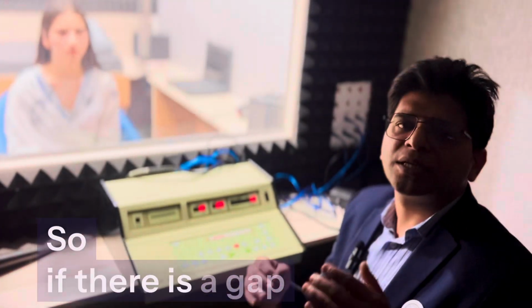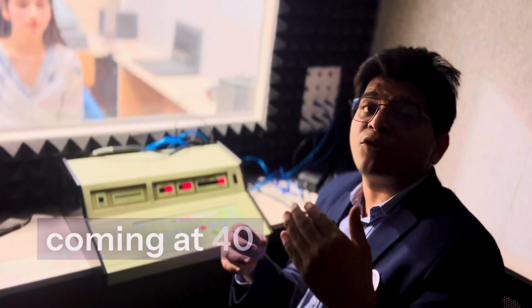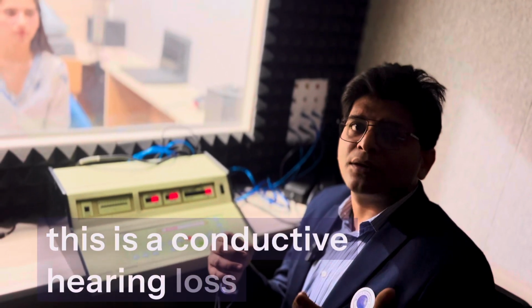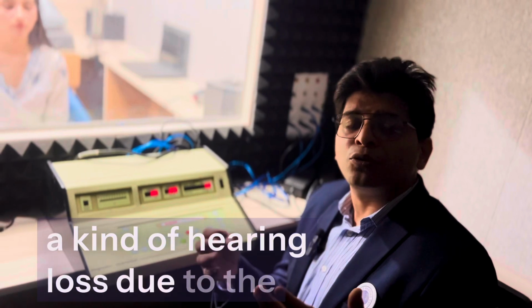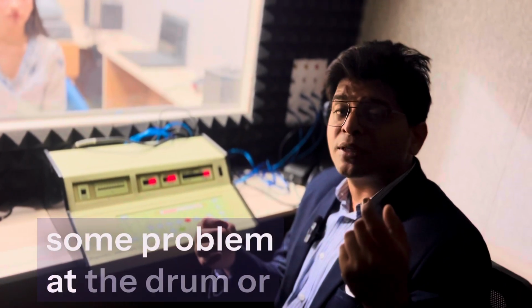So if there is a gap between the bone conduction, which is coming out to be at 10, 15, 20, and the air conduction, for example, is coming at 40, so there is a gap between the two, so that I can understand this is a conductive hearing loss, which is most probably a kind of hearing loss due to the obstruction. There is some infection at the level of outer ear, or there is some problem at the drum or in the middle ear.